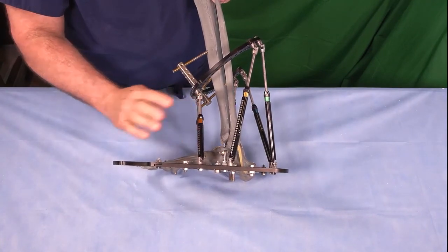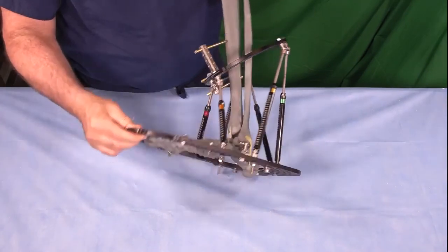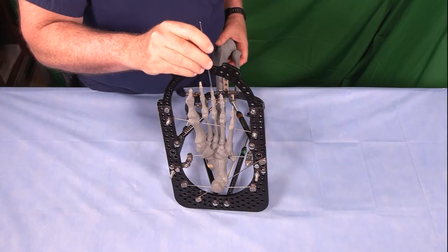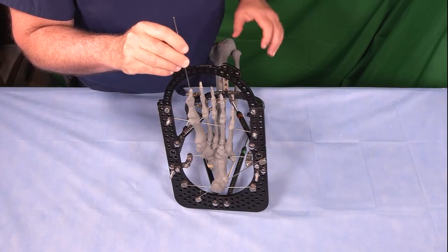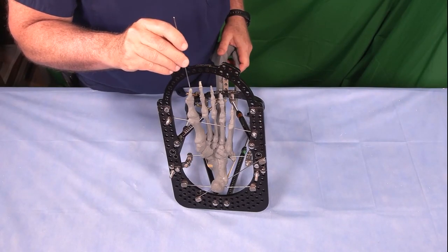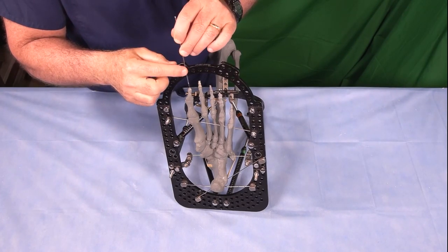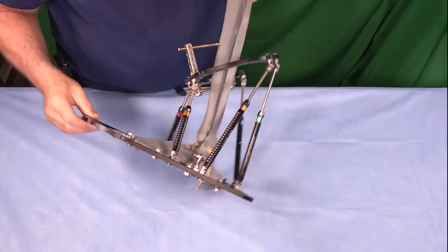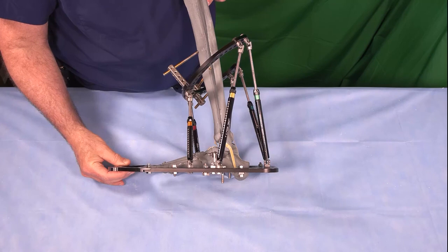And just want to point out one more thing, that when you do hyperequinus corrections, it's not a bad idea. I didn't do it for this exercise, but it's not a bad idea to insert pins in each of the toes, because as you go from a hyperequinus position to a dorsiflex position, the toes get very tight. That's very easy to do just by drilling longitudinal pins at the end of the case and incorporating those pins with a wire fixation bolt into the front of this foot ring. And that concludes the hyperequinus exercise for this Hexapod fixator. Thank you.